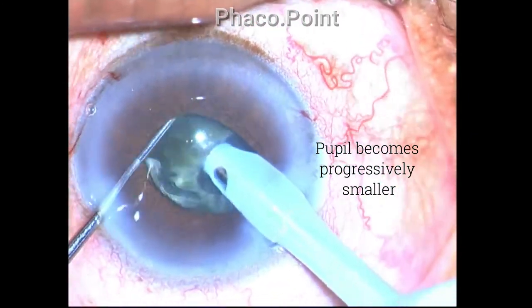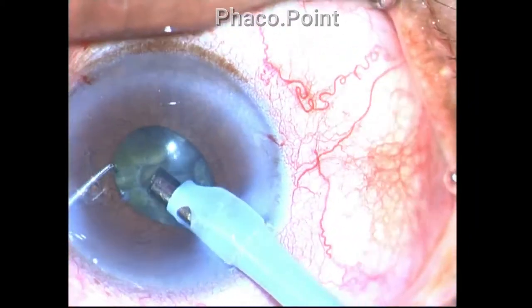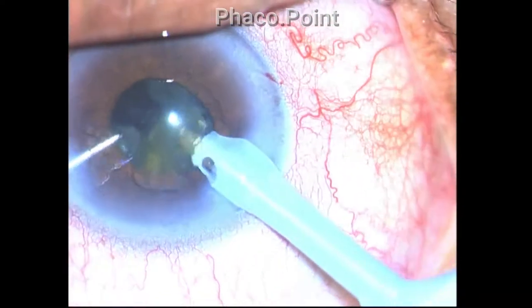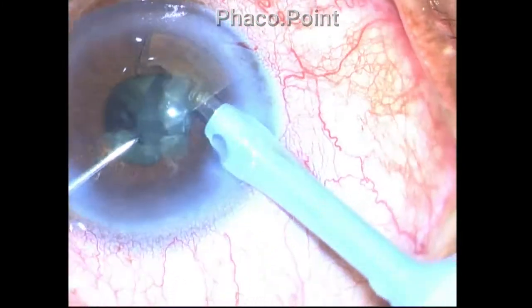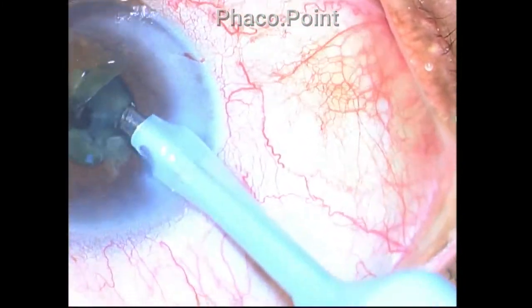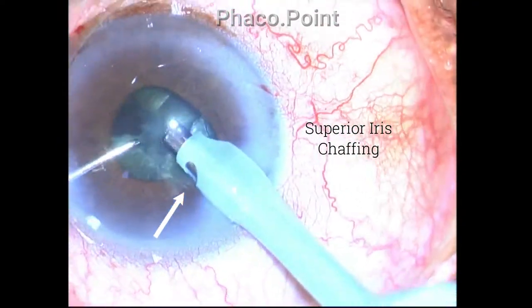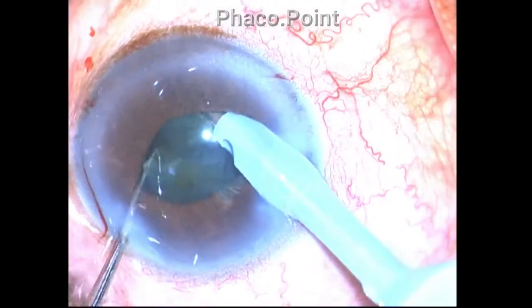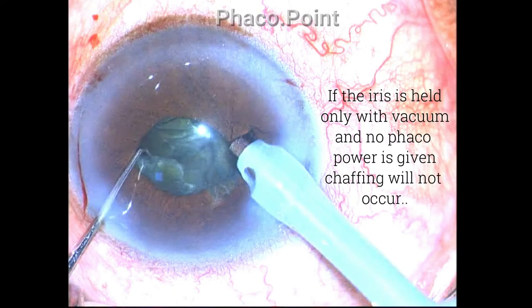The pupil is progressively becoming smaller, and at this point as I am evacuating a piece, iris chafing occurs at the sub-incisional area. Once iris chafing occurs, there is a tendency for the iris to keep getting sucked into the phaco probe again and again. I try to keep my phaco probe away from it, and only succeeded in holding the opposite portion of the iris.